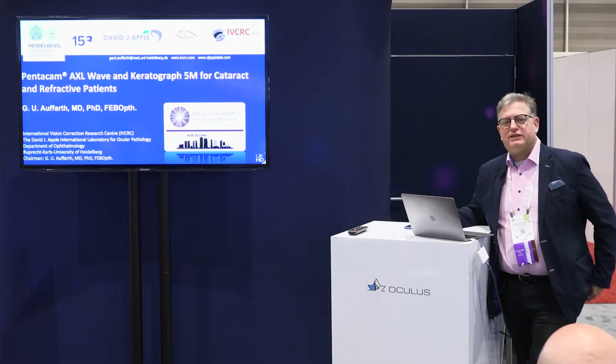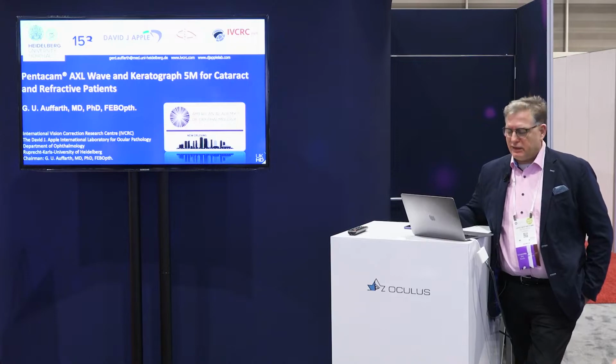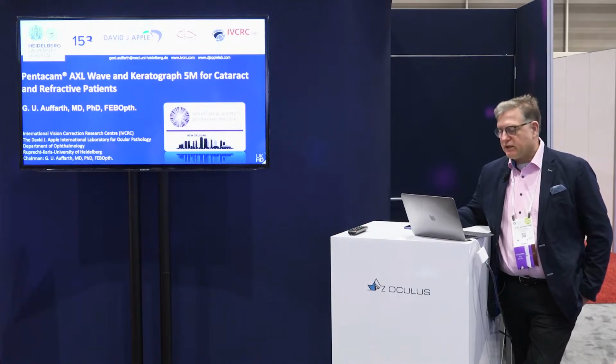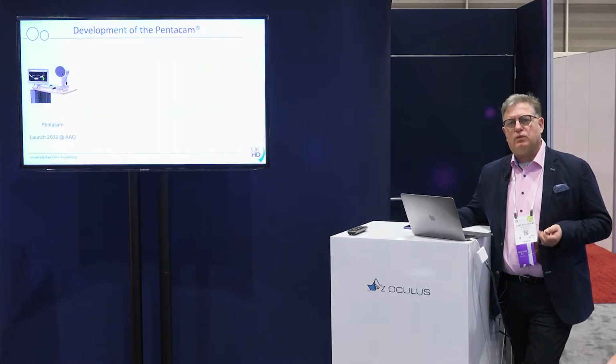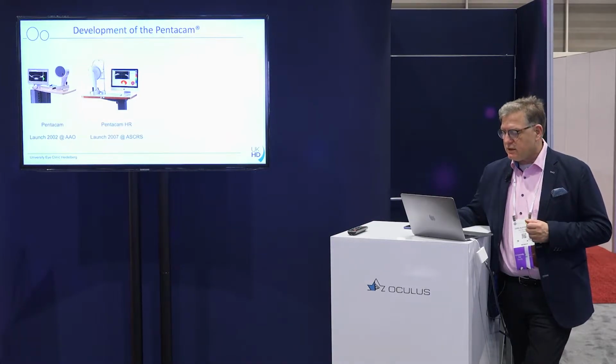I will share with you my experience with the Pentacam and Keratograph family and how we use it for cataract and refractive surgical patients. Almost 20 years ago, Pentacam was launched here at the AAO. This was the very first version of the machine. Then the Pentacam High Resolution came in 2007, launched at the ASCRS.